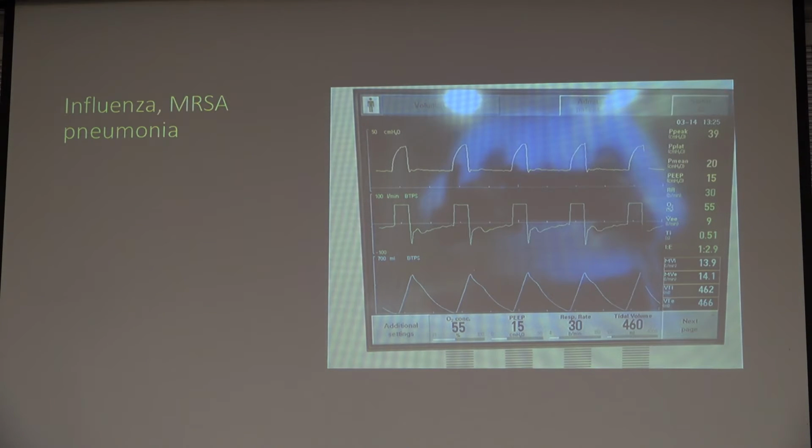All right, next patient. Again, sorry, lower quality graphics here. This is a patient with influenza, MRSA pneumonia. And what do you see in this person's waveforms, besides my reflection in my phone?